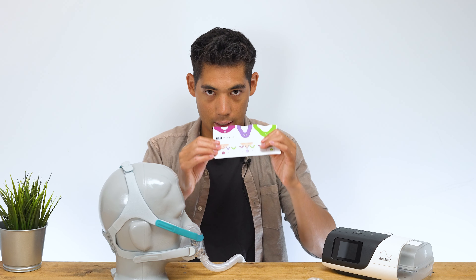On the front here we have this velcro soft material, and we can just take this off. As you can see there are a few different variations of sizing marked there. I think it probably would have worked without that, but with it you can memorize which setting is yours — say you're in the middle — so when you're washing it and taking it apart, you can put it back to the exact same spot. It's nice that they added those grooves.